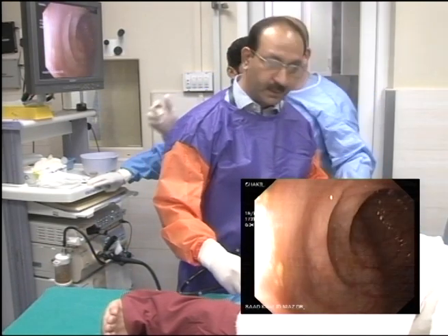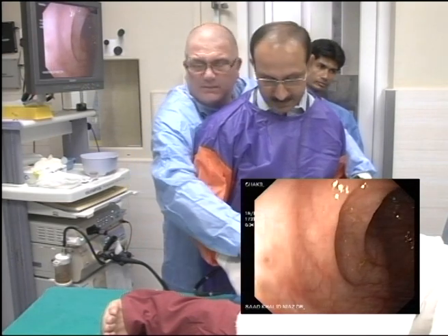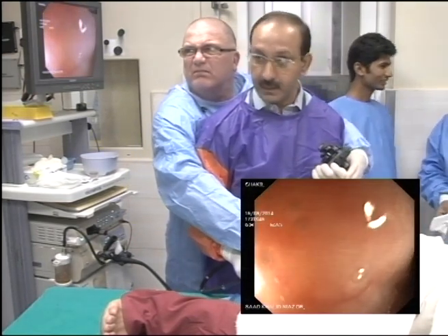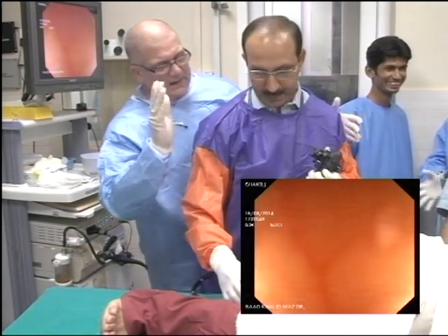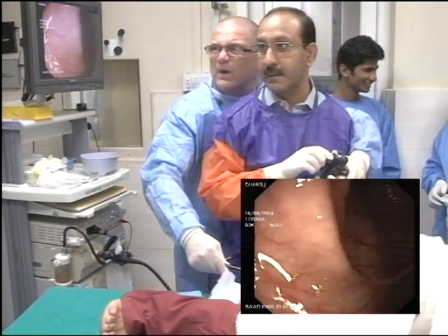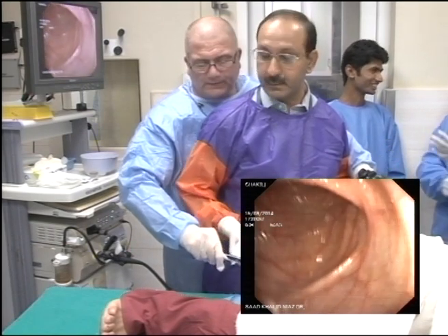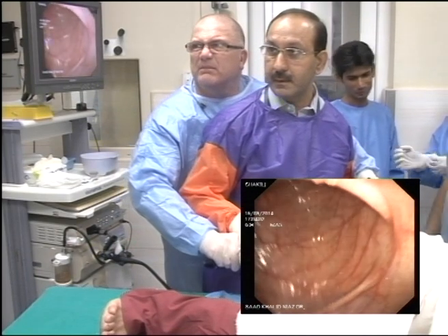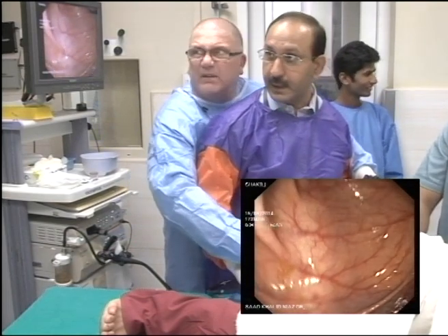So read there. Look at the screen. No. So your big wheel is forward, and that's how come I knew that's what was happening there. So to go left, it's here. Draw back, hold on to that. Advance. Now, advance.